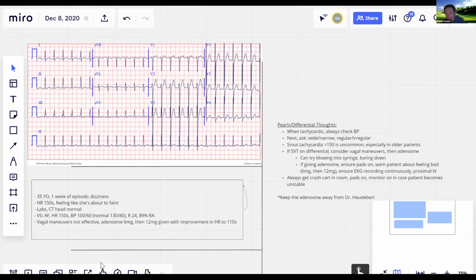So I actually have had patients who had this like once a month. Then I've had other patients who could tell me when it was going to occur and knew what the triggers were for it. Those people are a lot easier to do an event monitor. I once sent someone home for 2 months with an event monitor. She never had an event. 2 months later, she finally had an event and showed up in the ER and we were able to document it. But that's the key thing. And this is the story of my friend: if you can't document it, you can't get EP to try to fix it. They need to see an EKG that shows the PSVT at some point in time.